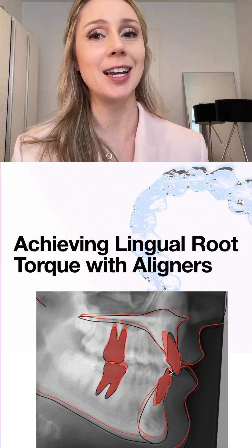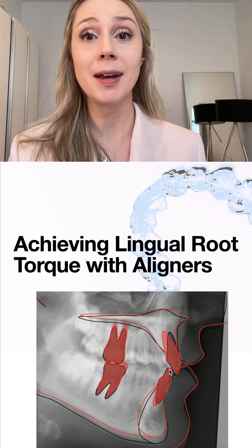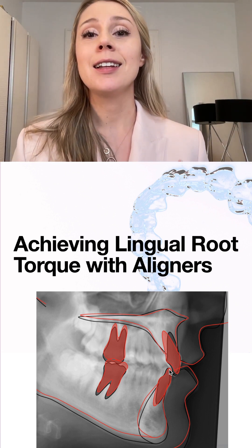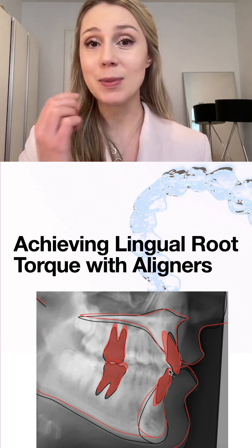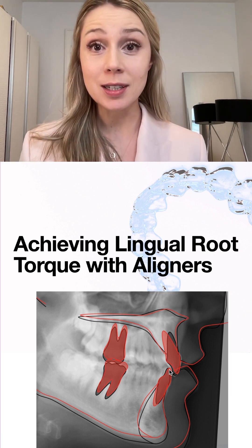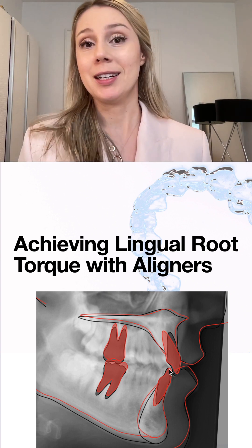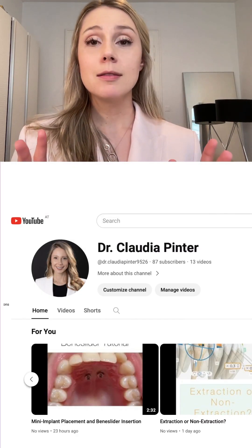What I use now is Spark aligners — I'm sure it works with other aligners as well, so please give me feedback. But what I would get when I planned lingual root torque in incisors was that the aligners would stop fitting: little spaces would form between the incisal edge and the aligner, patients would have difficulty speaking, and we needed to do a refinement scan right in the middle of treatment because continuation was not possible.